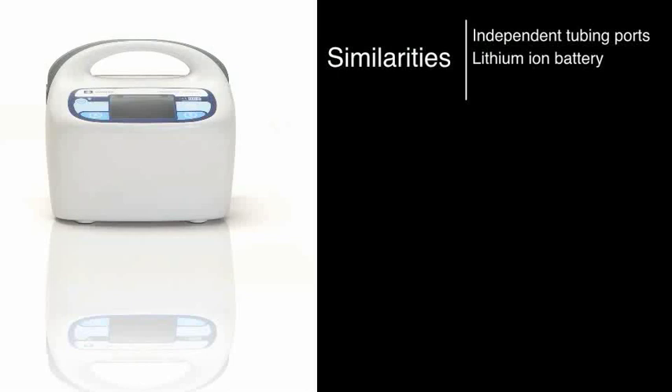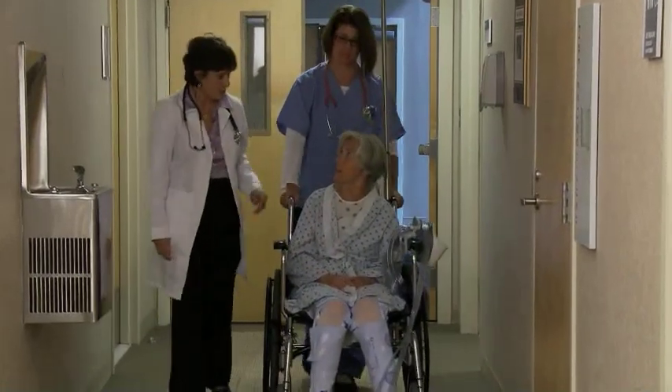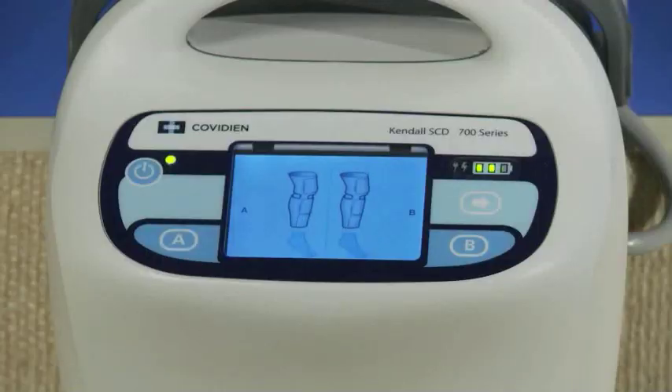The controller features a lithium ion battery with up to eight hours of battery life so that patients can receive prophylaxis during transport. Vascular refill detection, or VRD, is unique technology which measures refill times and customizes its compression cycle to each individual patient. VRD has been shown to move significantly more blood over time compared to IPC without VRD, thus reducing stasis and the potential for clot formation. Regardless of patient position or vascular competency, VRD automatically adjusts its cycle to the patient without nurse intervention.